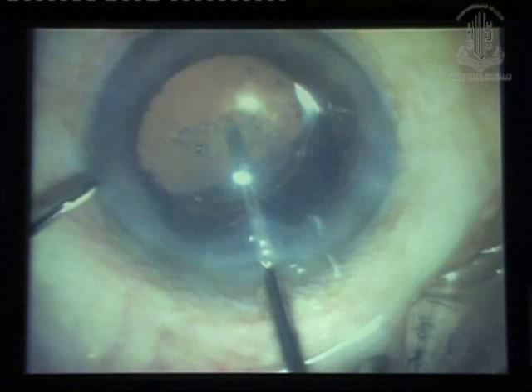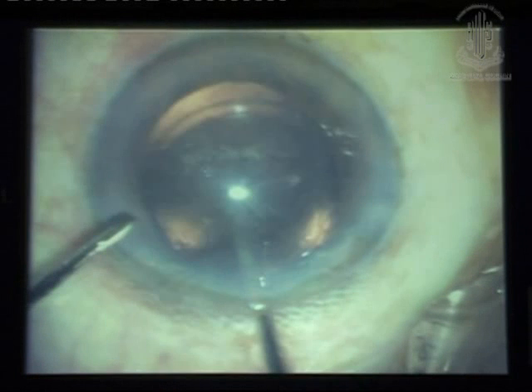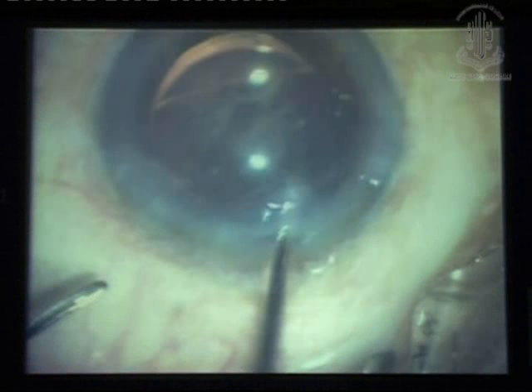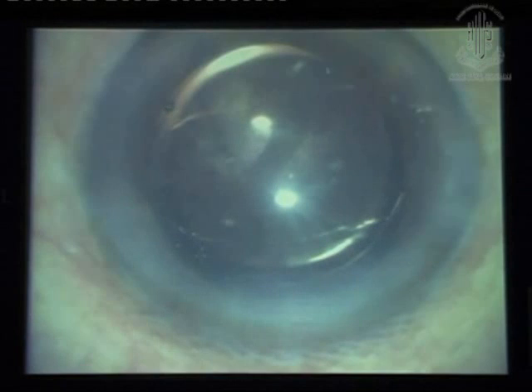Now I am going to do a rhexis capture of the optic. This is essential. If you don't do this, you are asking for trouble. Once I've done this, I'm happy with the centration, and this is the post-op picture.